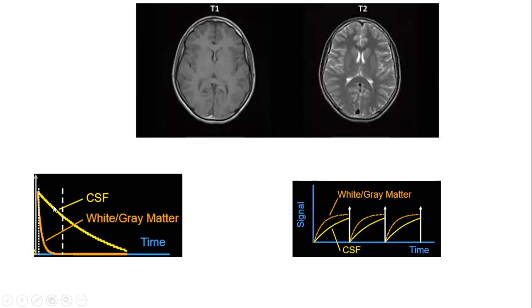We begin to have an enhancement of contrast due to T2. So if you wait for a sufficient amount of time, you're going to have better T2 differences. So this T2 difference will be enhanced with larger TE. The diagram is not so explanatory.